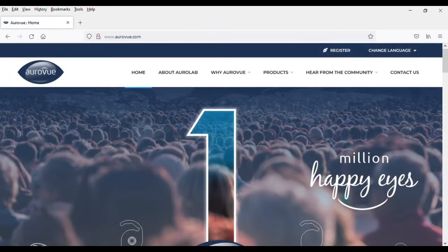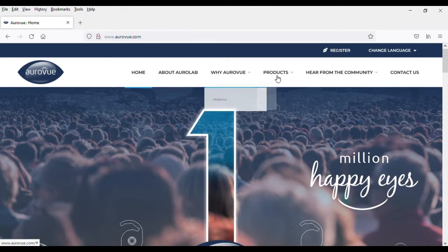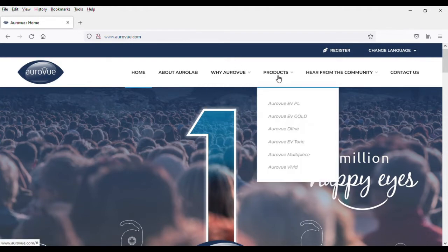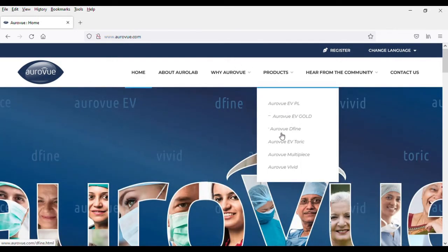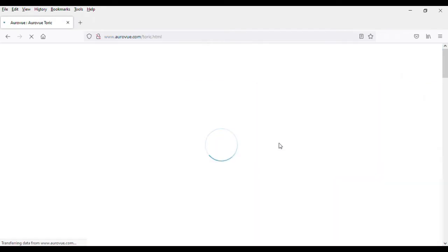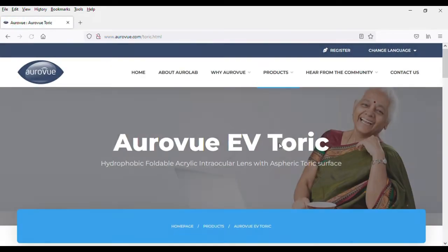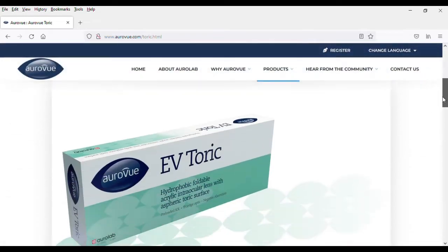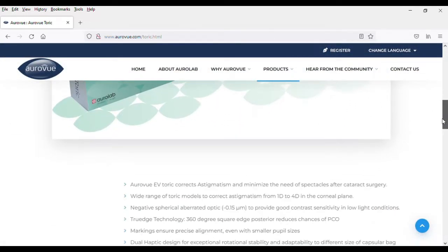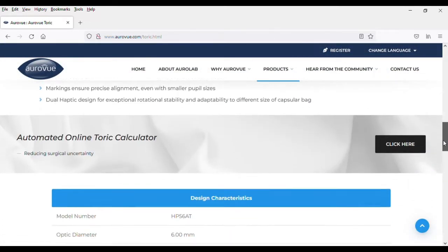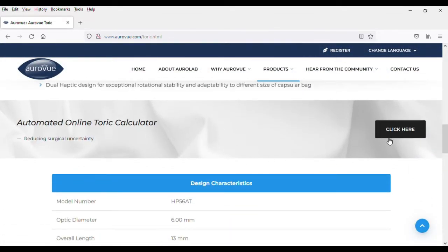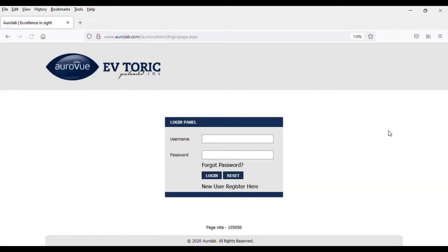On the website, you can see the top menu selection. Select Products, and on the drop-down menu, select Oroview EV TORIC. Scroll down, and you can see the clickable button to the calculator. Click it, and it will guide you to the calculator.